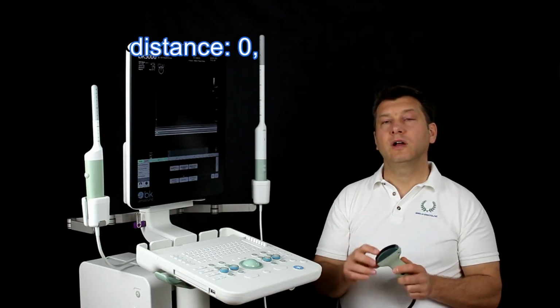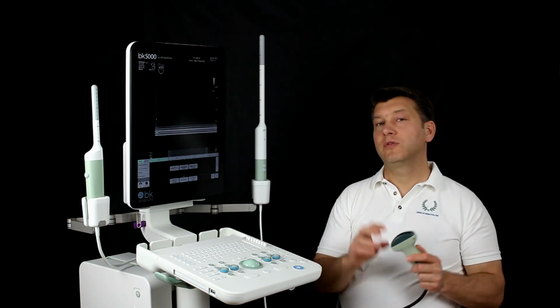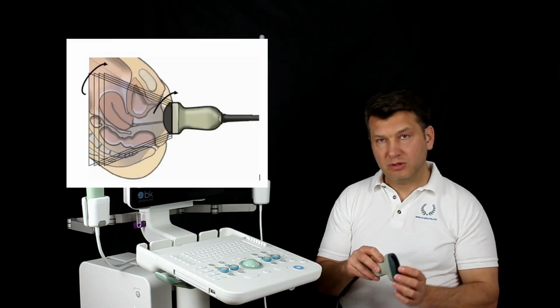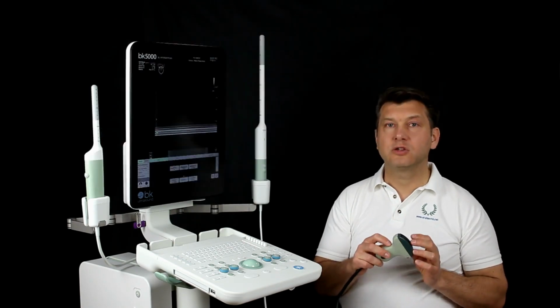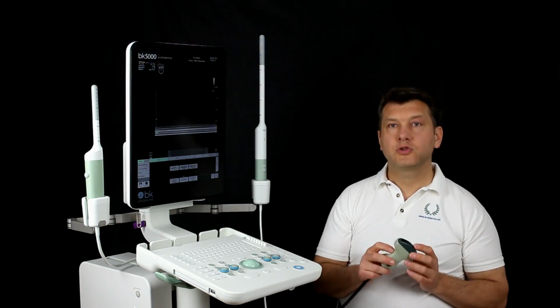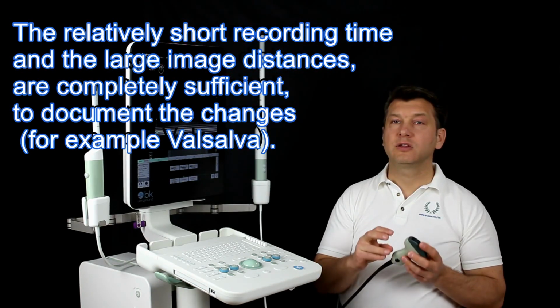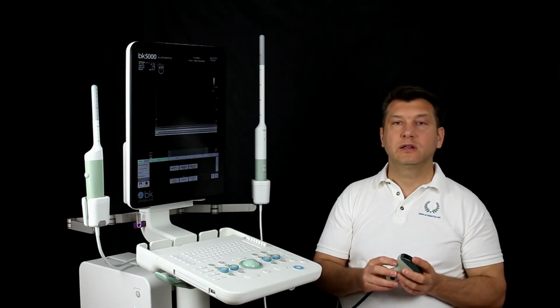Distance 0.5 mm. The choice of the fairly large distance of 0.5 mm is based on a perspective. When taken, the image is indicated by a tilting movement of the hand by the examiner. This happens quite quickly and should above all be carried out evenly. The relatively short recording time and the large image distances, however, are completely sufficient to document the changes, for example, of a rectocele or enterocele as well.